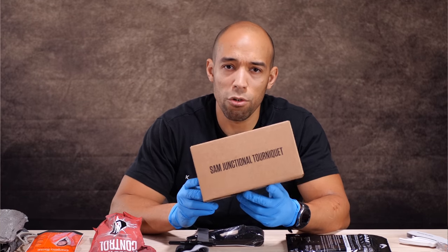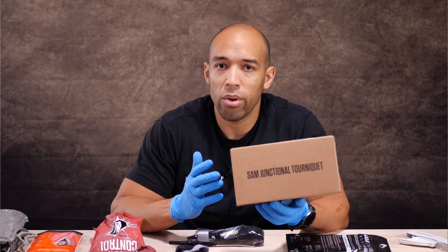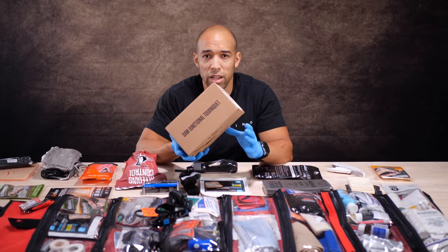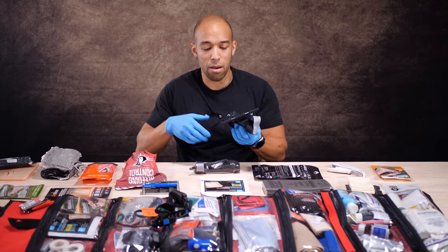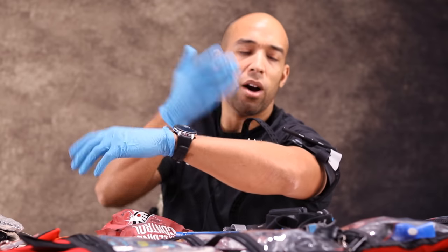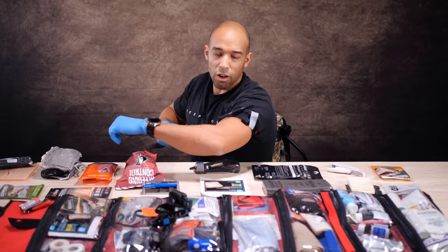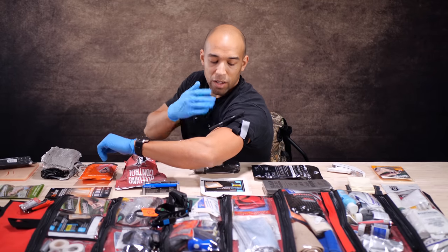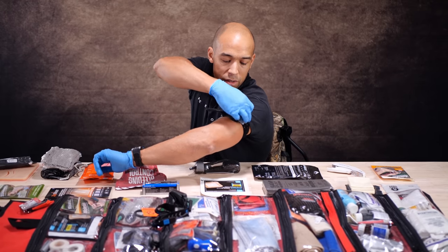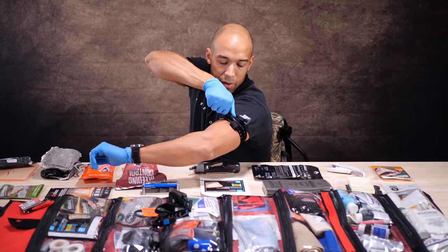A junctional tourniquet is probably worth it if you have a large group, a family, or if you're the prepper who has everything else. Hopefully you'd never have to use it — money well wasted, I would say. The great thing about the SAM tourniquet is it works really simply. If I got shot in the arm, I just pull on this and it clicks — almost self-directing. That lets me get tension to stop the bleeding. Then I can spin the windlass and tuck that in there.